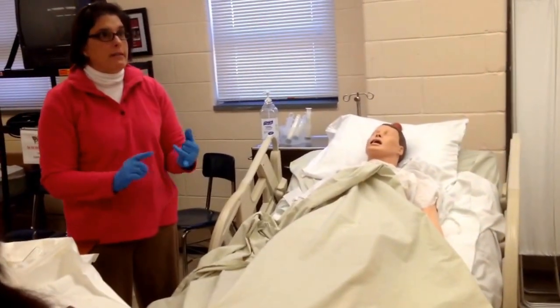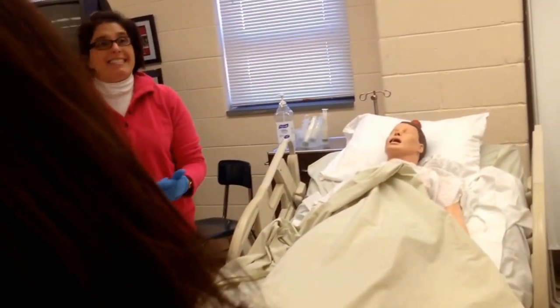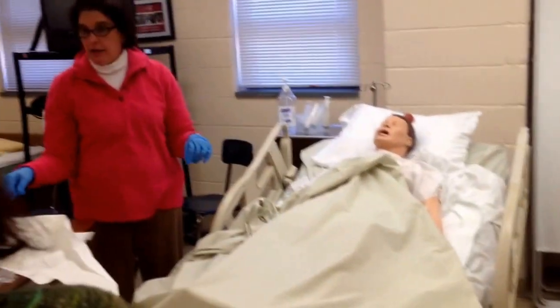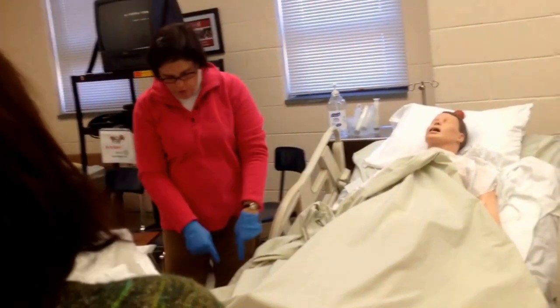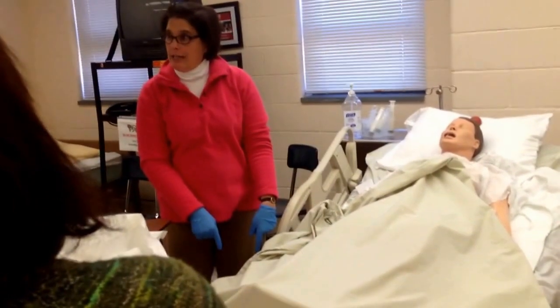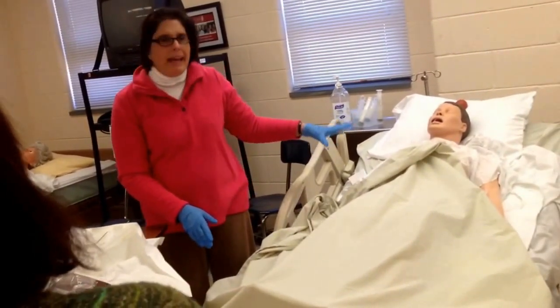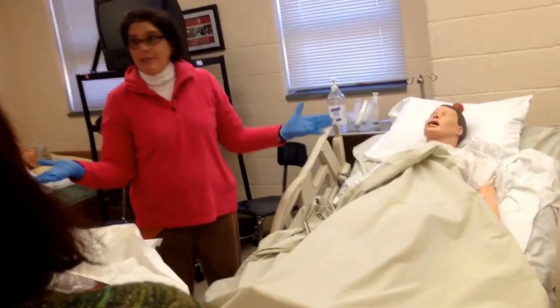You're going to document the date, the time, the type of catheter you inserted, the size of the catheter, which is a 16 French, how much water you instilled into the balloon, which on this catheter is 10 ml, even though it says 5, 10. And then you're going to document color, odor, consistency, and amounts of the urine. Okay? And if the patient tolerated it well, did they show any facial grimacing or pain or discomfort while you were doing it? Okay? And that's all there is to it.